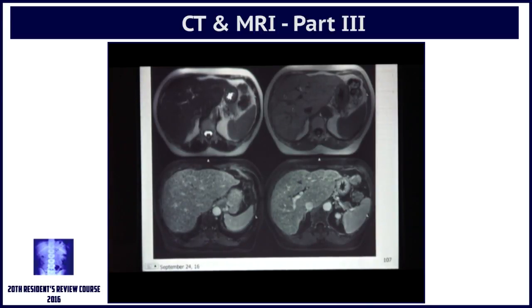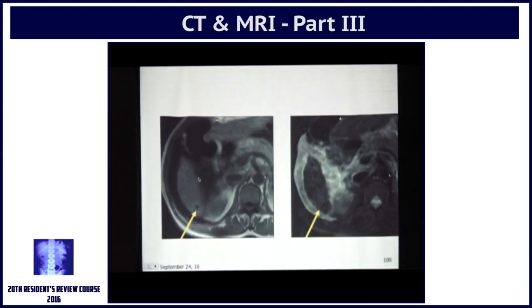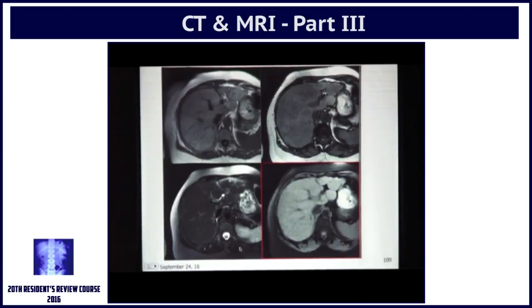Here are four images: T2, T1 pre-contrast and post-contrast. You barely see the lesions on the pre-contrast images, but on the post-contrast images you see these small hypo intense lesions, which are nothing but regenerating nodules. Another example shown is a siderotic nodule.